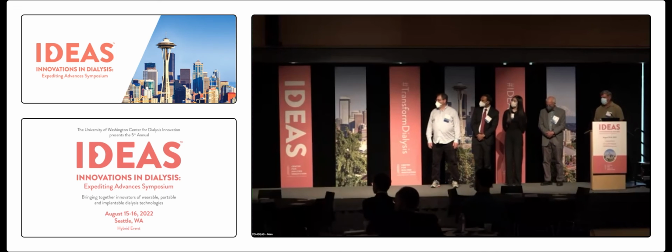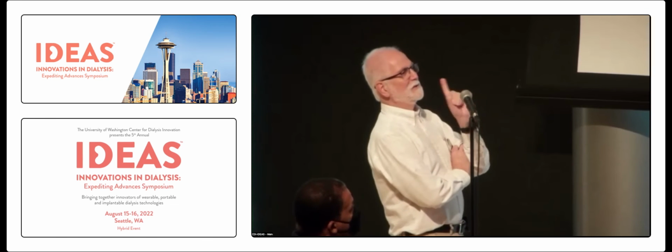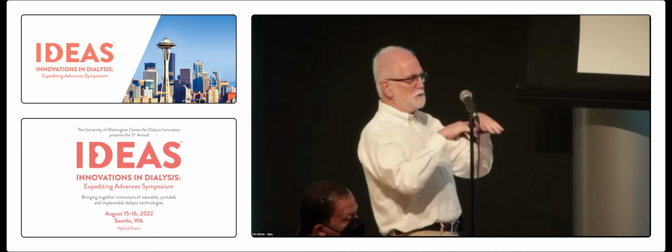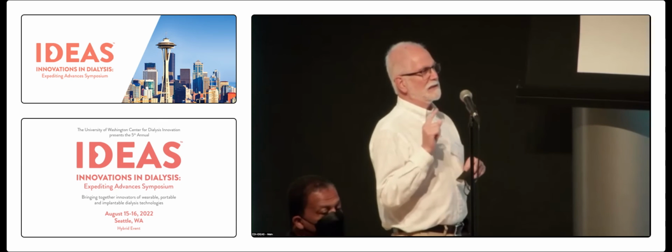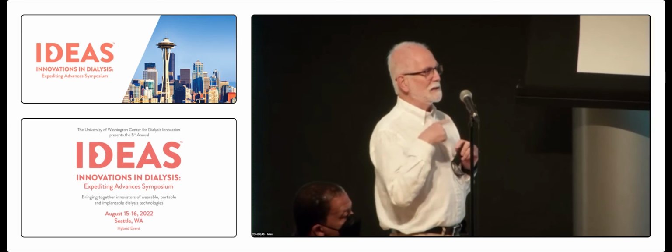Paul Yeager, University of Washington. I want to say I'm very impressed by the technical progress here, and as somebody with a degree in chemistry, I'm impressed. I've got a quick question for Professor Narasimhan, though. I love the idea of moving the clots to the other side of the cartridge, but the good thing about having the clots forming inside the tubes is that they're then stuck. Yep. Where they don't get back into the patient.